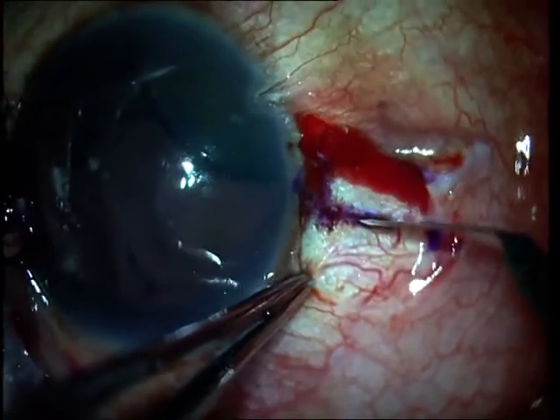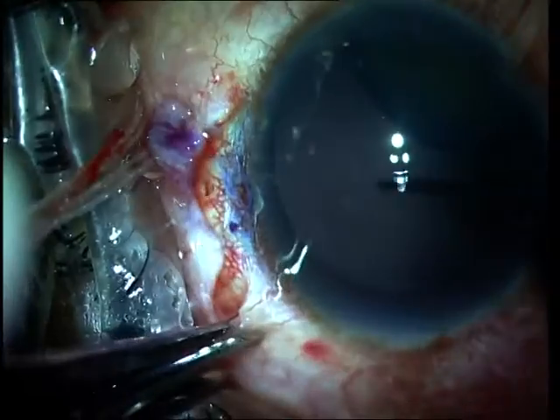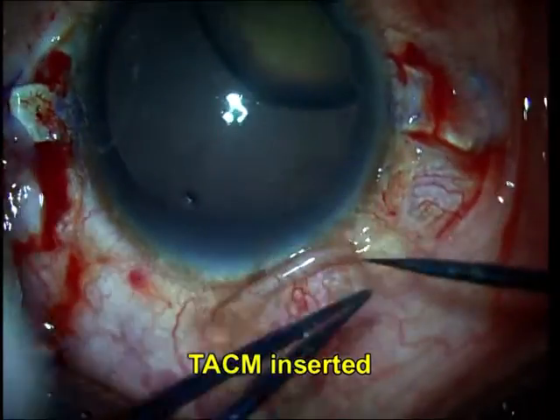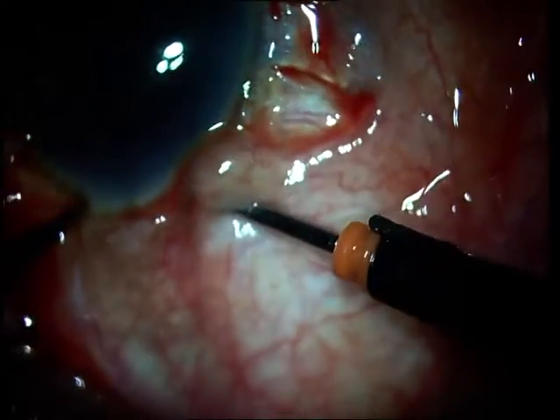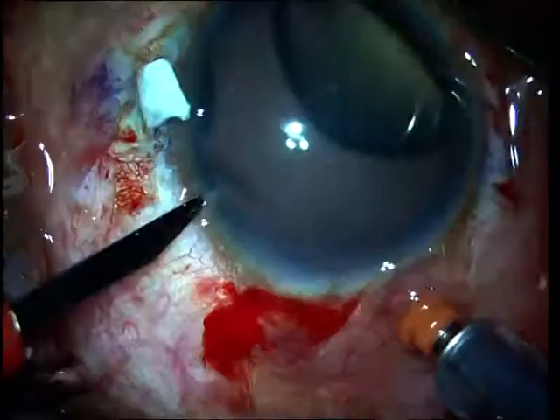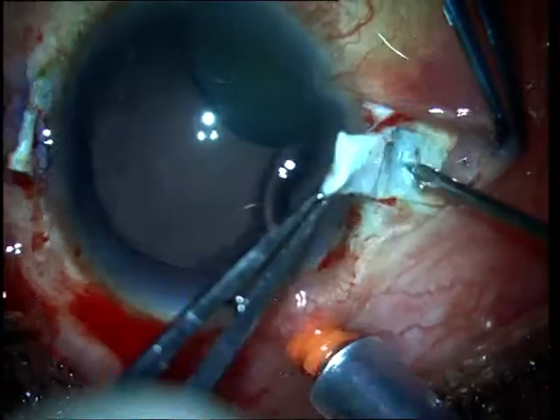Since I have verified that I can go in for a horizontal glued intraocular lens, I have created flaps that are centered exactly opposite each other, and once these flaps are created I insert a trocar anterior chamber maintainer. I shifted the conjunctiva and then go through the sclera creating a tunnel obliquely, then turn perpendicularly into the limbus and enter with the TACM.